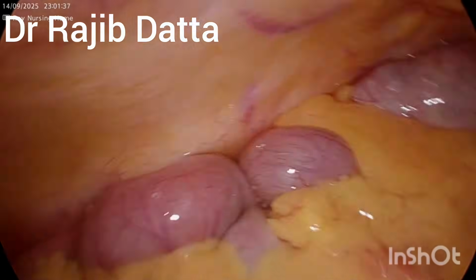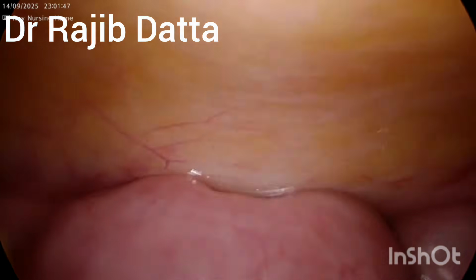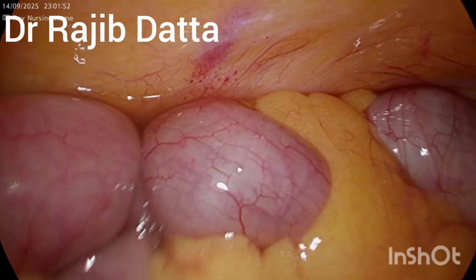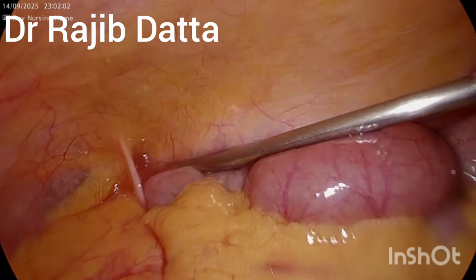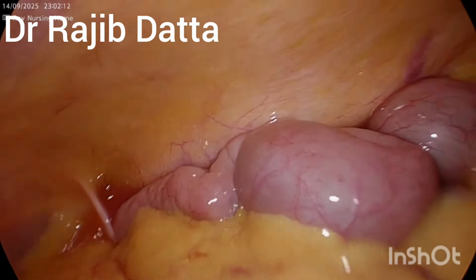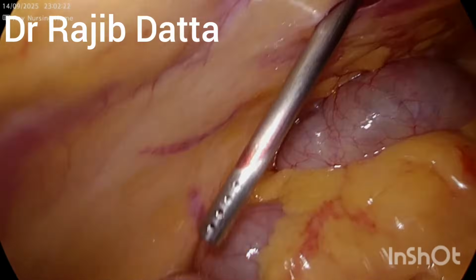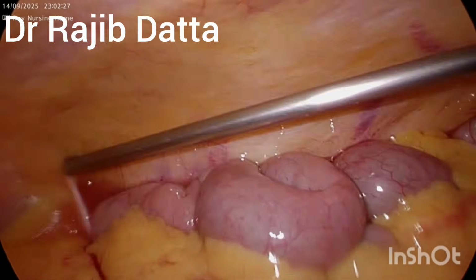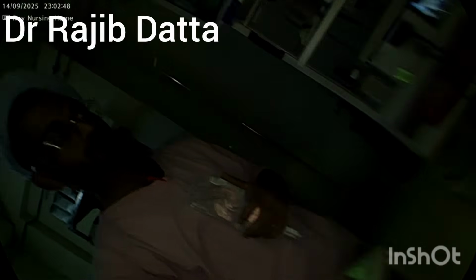And you can well appreciate that the cecum, the colon area, has to be also sucked out, making the abdomen entirely dry enough so that the post-operative recovery will be smooth for this patient.